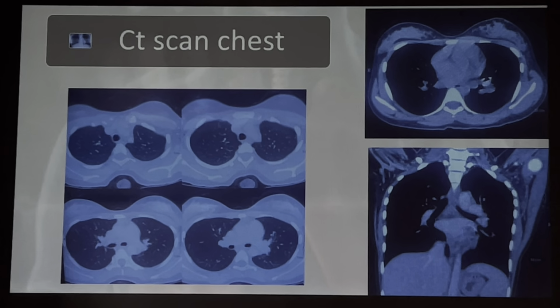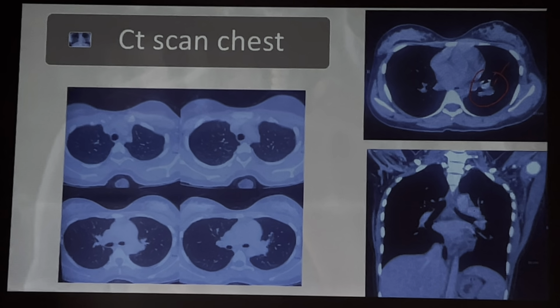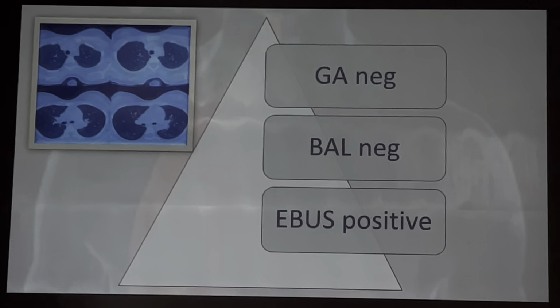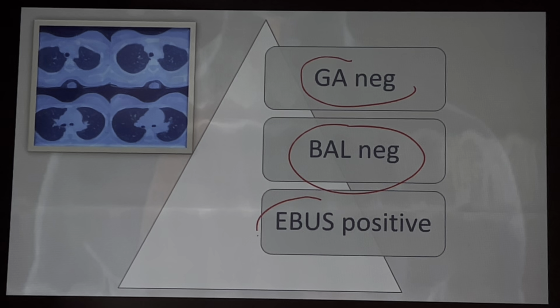On contrast, we could find that there is a necrosis, though it is a little bit uniform, but there was definitely necrosis in some of the cuts. You go for gastric aspirate, you go for bronchial lavage in this type of patient, but ultimately we have to go through the EBUS, what Dr. Chuk told us, that is your guided biopsy, right?